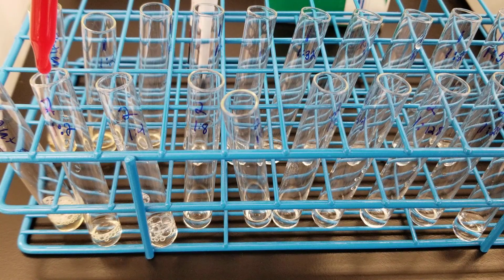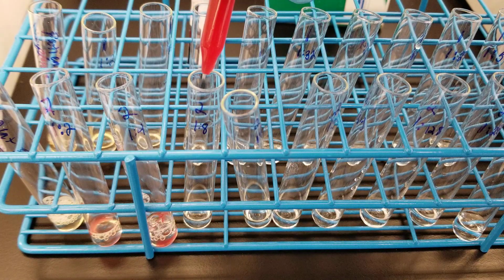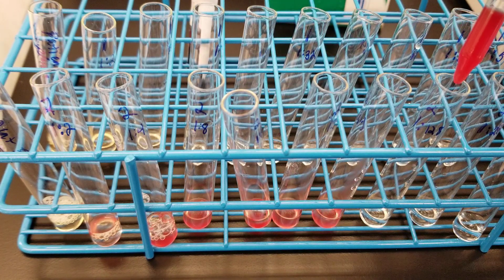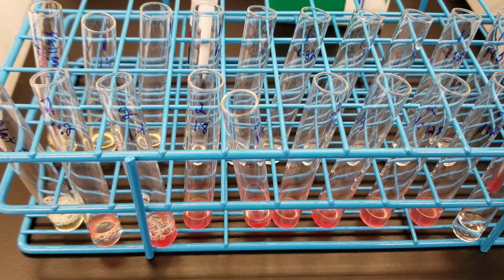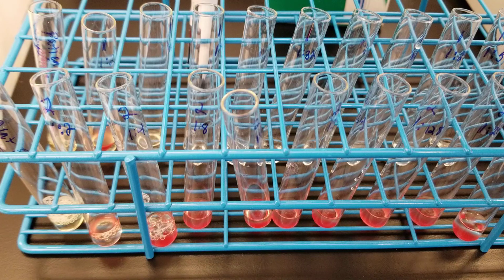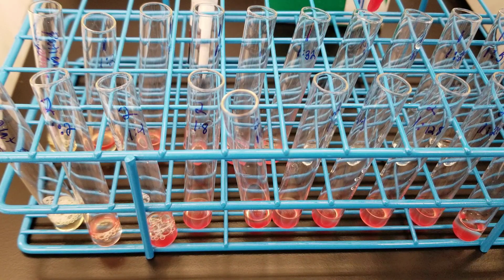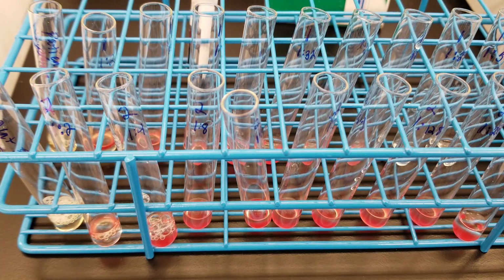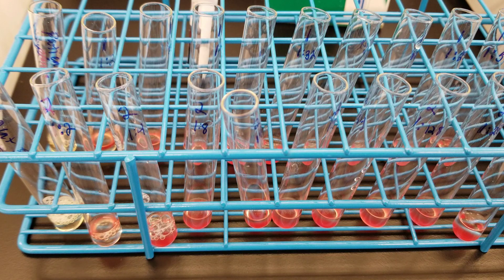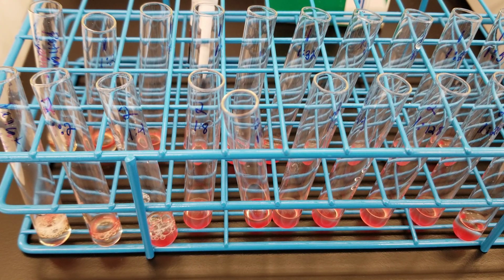So we've got them here. We're not going to put a drop in the throwaway tube, okay? Because the throwaway is just if we need to go back and look at it later, we've got it. It's kind of like a safety. Using a lot of reagent cell. Okay, so now I have my dilutions all the way from straight to 512.